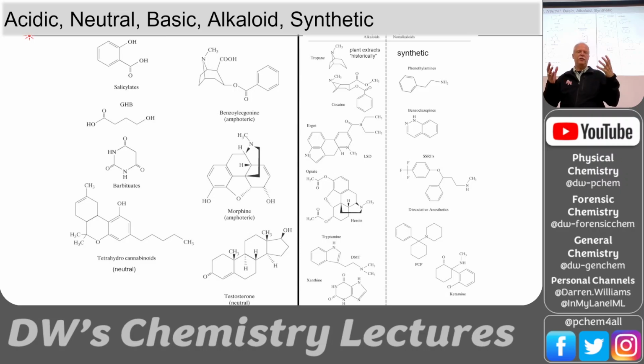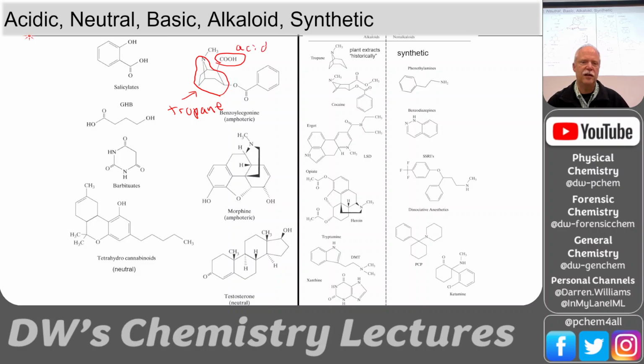So here's some of the drugs, just to show the point that using functional groups is going to be difficult, right? Because this is one of the metabolites of cocaine. I know that because it has this tropane ring structure here. It's also an acid. It's also a base. So you've got a substance that's in two categories. So is it an acid? Is it a base? It's amphoteric. It has both. Okay. You have some that are alcohols, some that are acids.